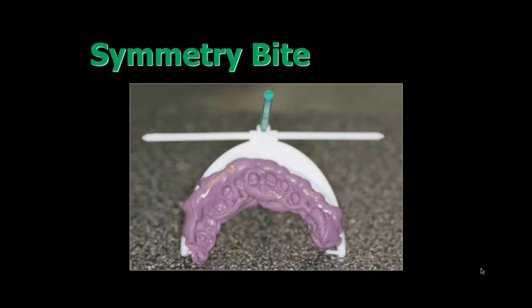When should monophase and medium bodies be used? I just showed some examples. I use monophase in my pickups for implants. I use it for my dentures, my partial dentures, and you can actually use it for all on four. You can think of monophase as very accurate, and also in diagnostic models. For your complete denture impressions, I use the monophase.